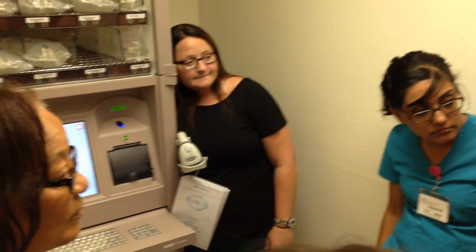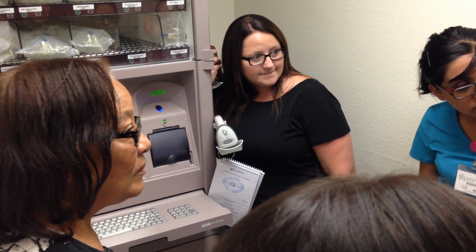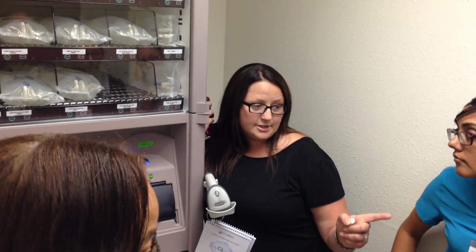Say I was in here getting something and Phyllis was like, hey, get me some for so-and-so. Nope. You should only pull what it is that you're administering. This is why you only pull one dose at a time too.